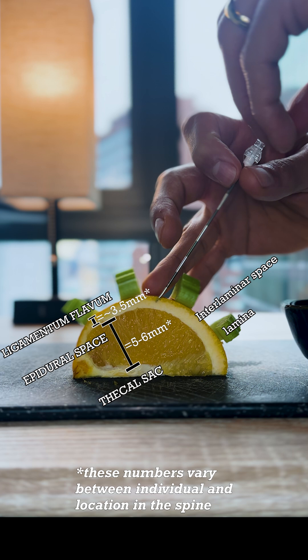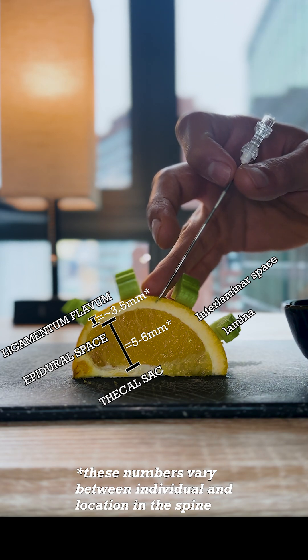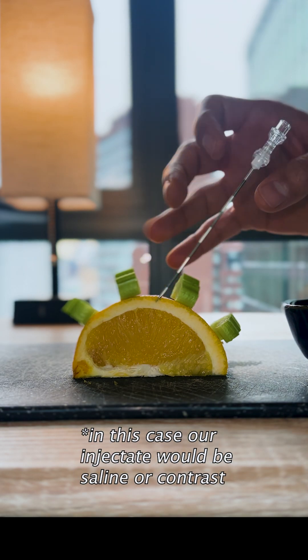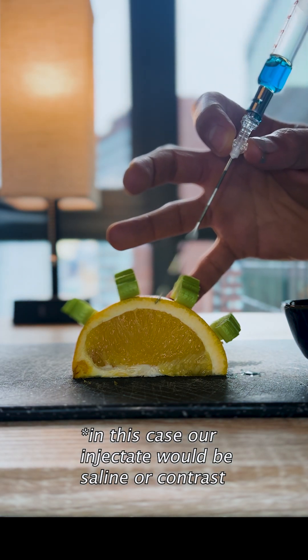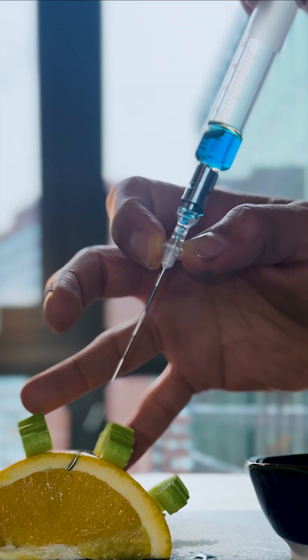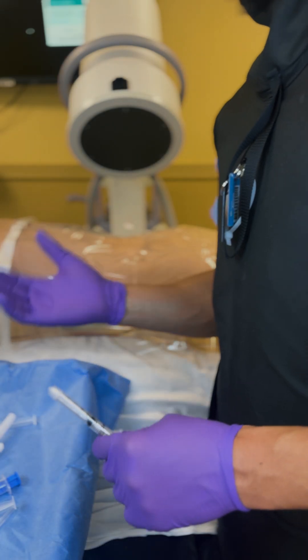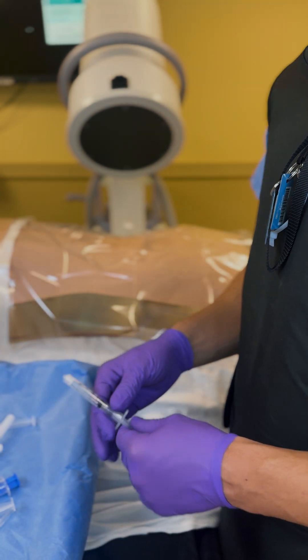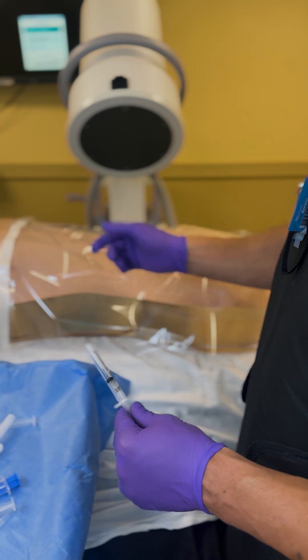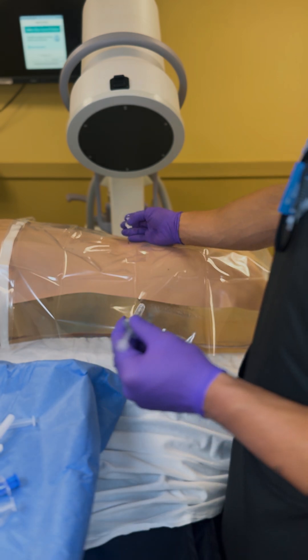Here's our orange epidural model: the orange pulp represents the epidural space, the orange rind represents the ligamentum flavum, the thecal sac lies anterior to this, and the interlaminar space is between the lamina celery sticks. Using a glass loss-of-resistance syringe with blue water to illustrate the injectate, at the most distal edge of the plunger you'll see a sudden loss of resistance, and the medication flows into the epidural space. Now we'll check contrast spread.